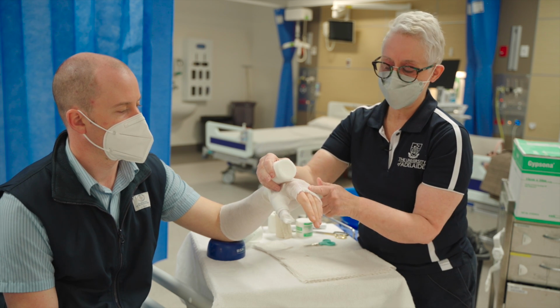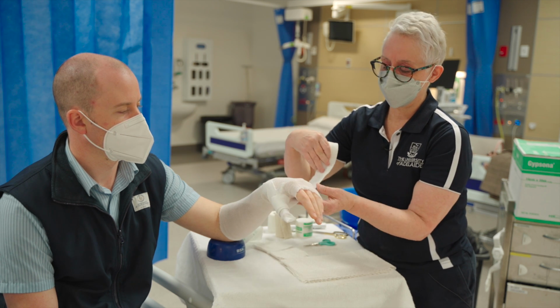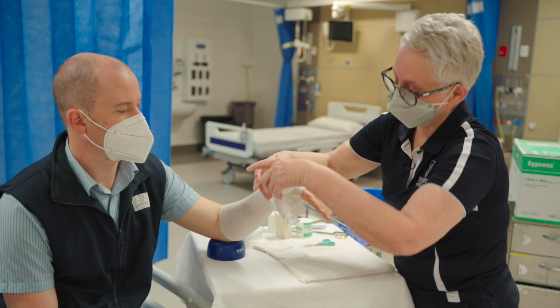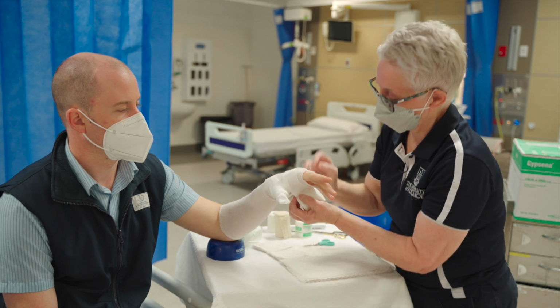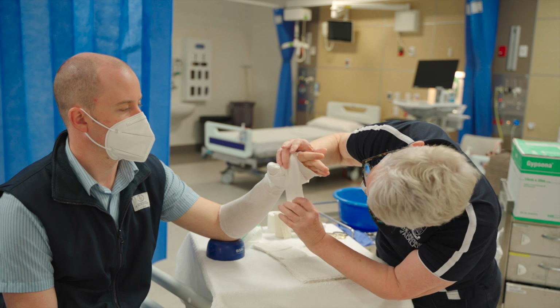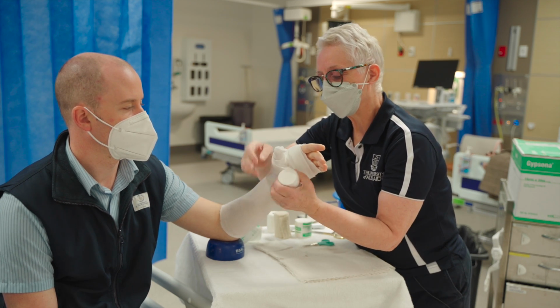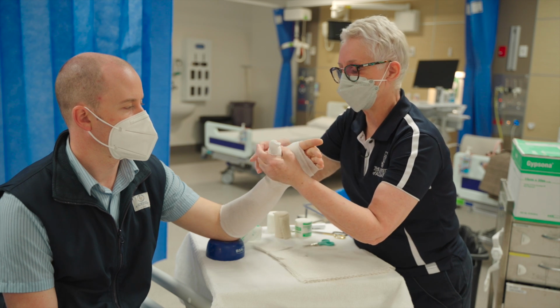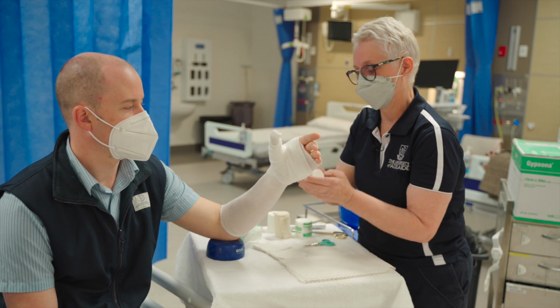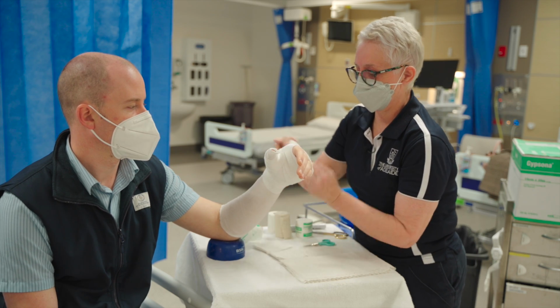If you make this padding far too long and come up over here, then your back slab's going to grow on you. So also make sure you're aware of your edges right from the start. Come around the hand twice, making sure you've covered everything, and start making your way down. I'm just going to come through that thumb space again. And we start making our way down.